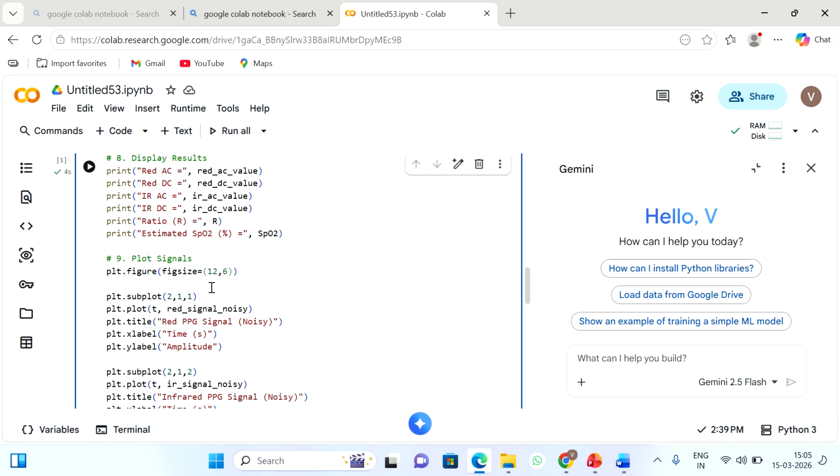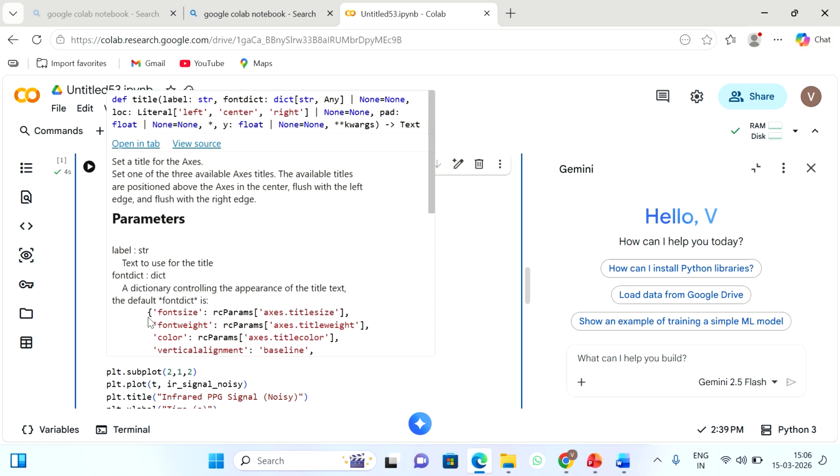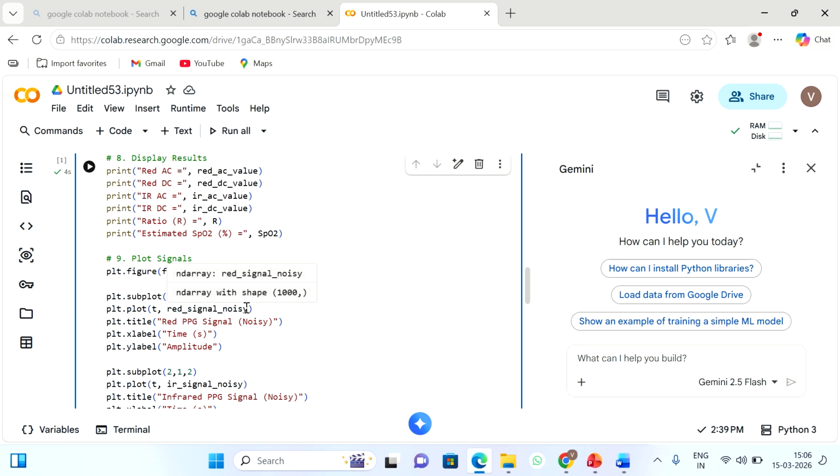So first, figure size is 12,6. Now what is the meaning of 12,6? Width 12 with height 6, and subplot. Along this we are going to have only two graphs, so two rows, one column. In the first position is the red PPG signal, the graph of time versus red signal noisy. The x-axis is time, and the y-axis is amplitude in volts.